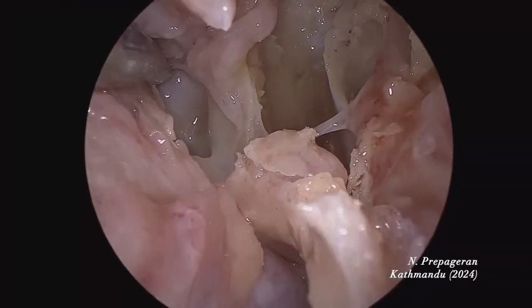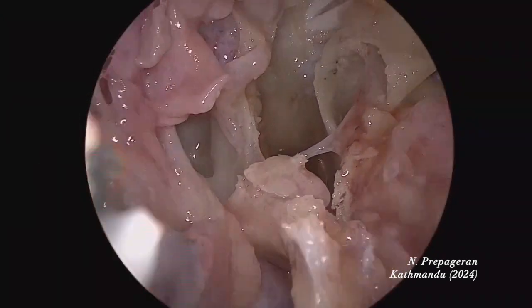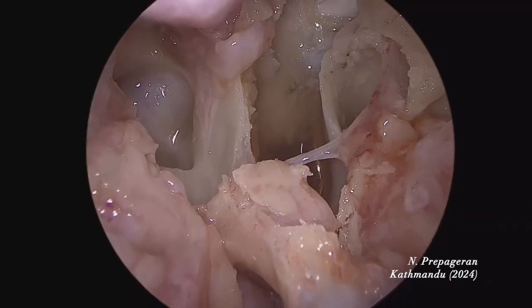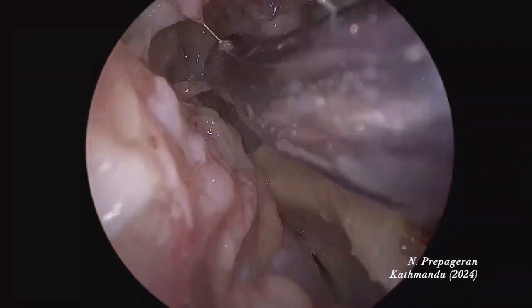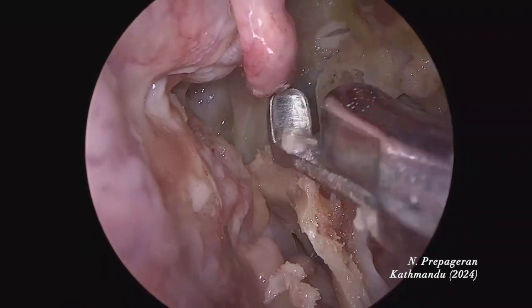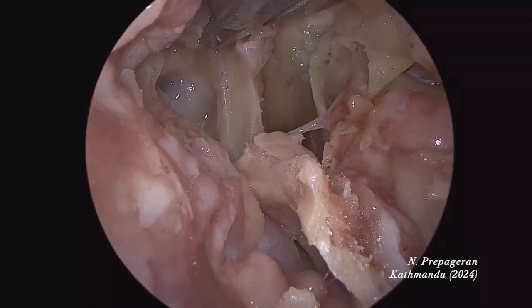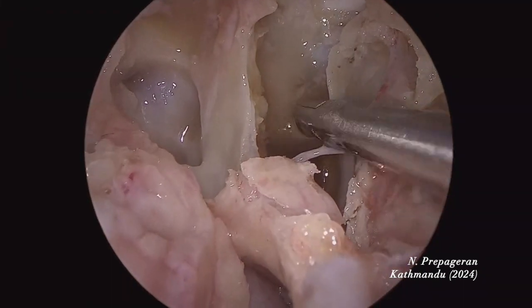I'm going to push all the structures away. Remember, on this side we didn't do a flap at all — turbinates and everything is intact. You do not have to damage anything on the right side; you can just push everything away. I'm going to expose the optical carotid recess. I can already see the OCR. I'm removing the mucosa and the upper part of the planum so it's exposed. Now we are into the sphenoid sinus itself.